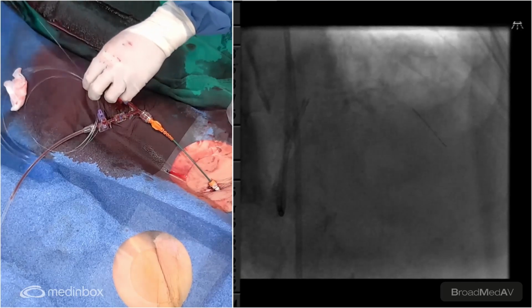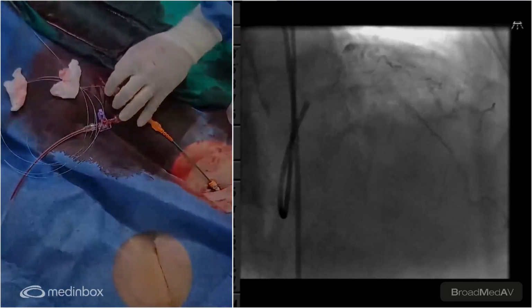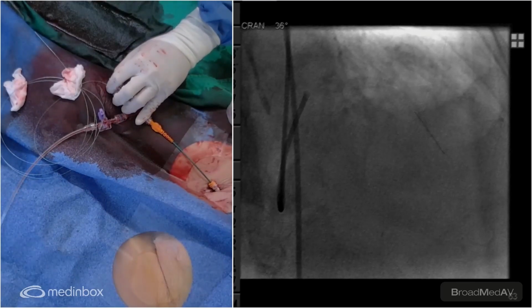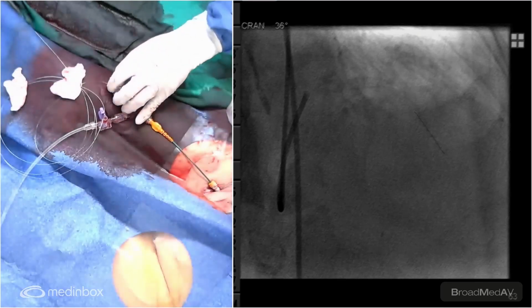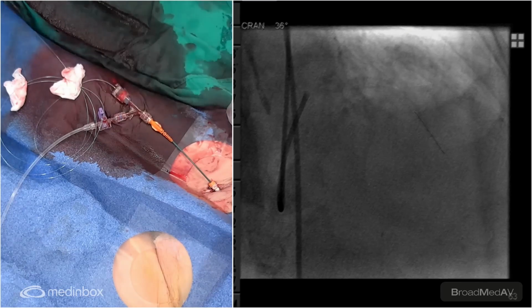Okay, little puff there. Intro tool, please, and a balanced middleweight. That looks pretty good. Okay, let's go with our BMW, and then we'll rewire. And at this point, I think I'm going to try a 3.0 NC, see how it behaves. You don't want to do the OCT again for fun? We need to see what happens to that. I like it. That nice nodule, even with a burr. We need to show the difference. I think so.